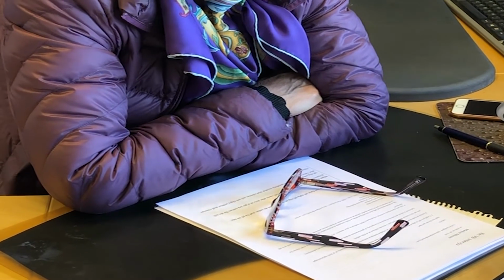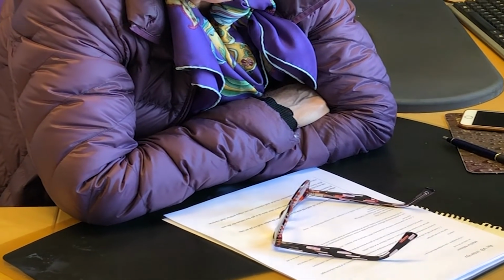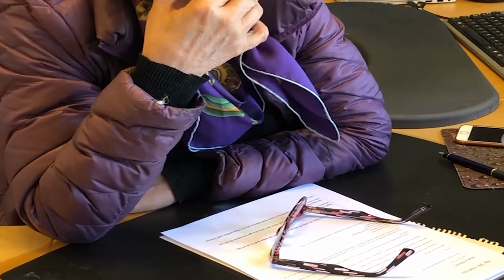The second thing is to see longitudinally in the same patient if it repeats and you get the same values, so that you know you can trust the measures you get to be exact and consistent, which we have somehow studied previously for the ADC and FA values. I don't doubt that it will work, but if we need some validation before we start doing it, those would be the two things, I think.